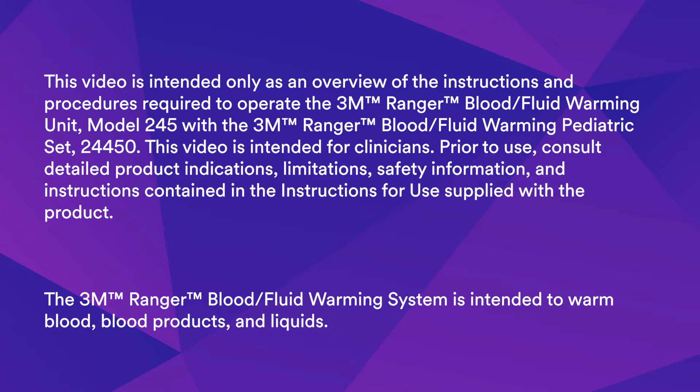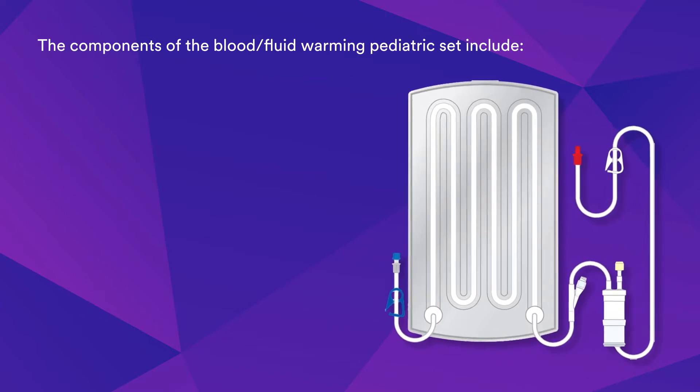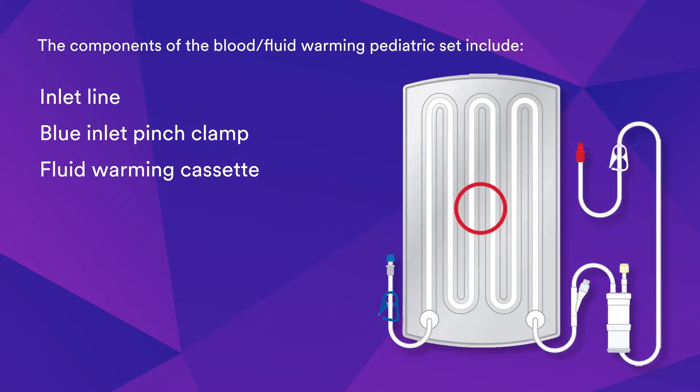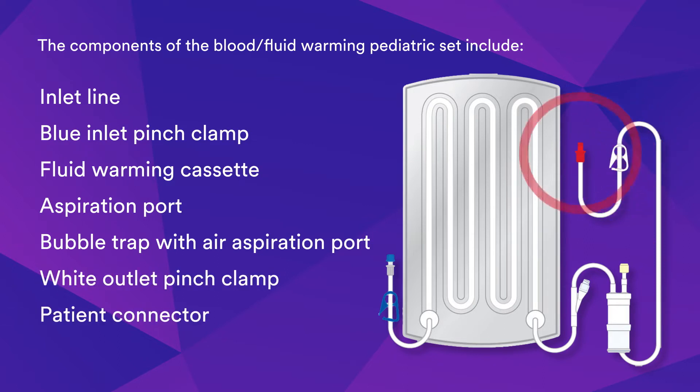The 3M Ranger Blood Fluid Warming System is intended to warm blood, blood products, and liquids. The components of the Blood Fluid Warming Pediatric Set include an inlet line, blue inlet pinch clamp, fluid warming cassette, aspiration port, bubble trap with air aspiration port, white outlet pinch clamp, and patient connector.